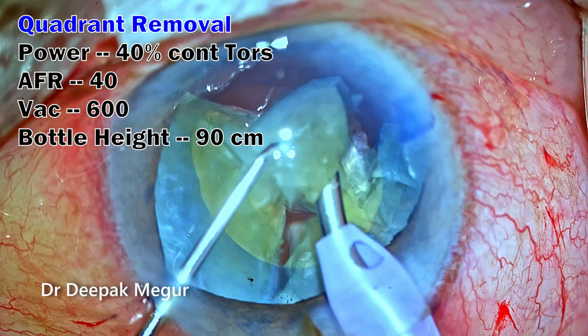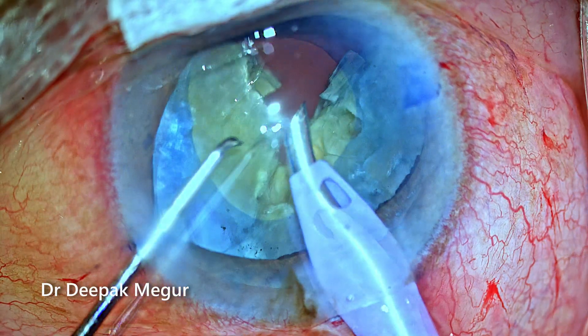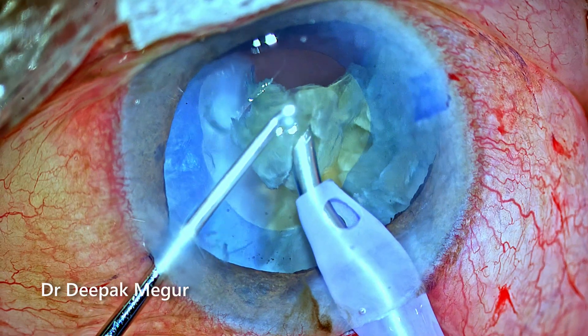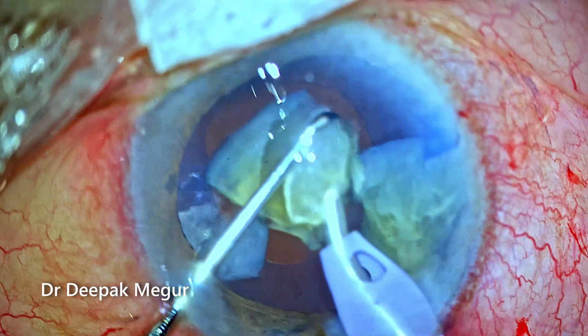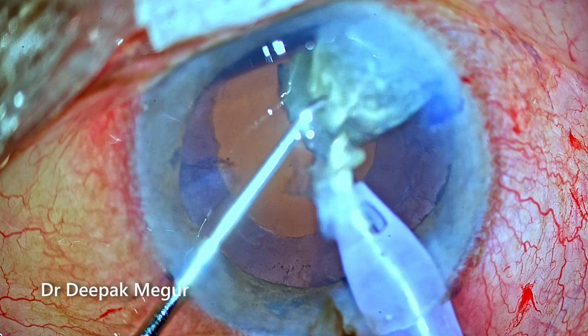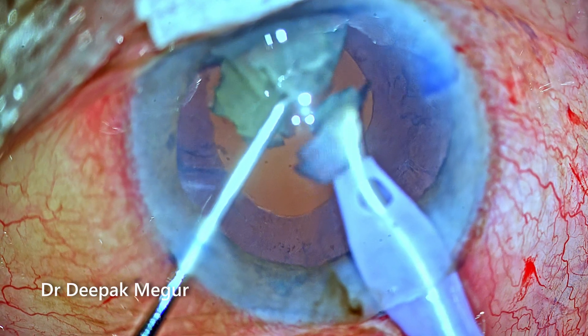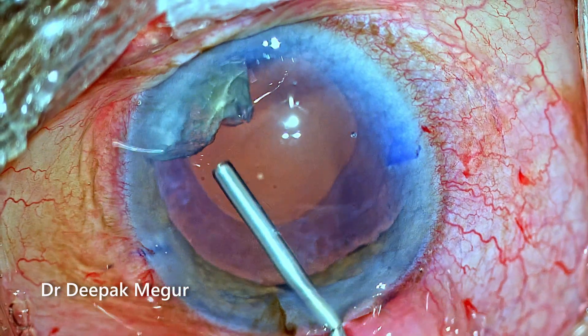Once I have around five to six fragments, it's time to emulsify each of these fragments — this is the easier part of the surgery. The most difficult aspect is getting the rhexis right and dividing the nucleus into smaller fragments. During fragment removal, care must be taken to minimize corneal endothelial trauma, so we need to be at the right plane and use a lot of dispersive OVD.